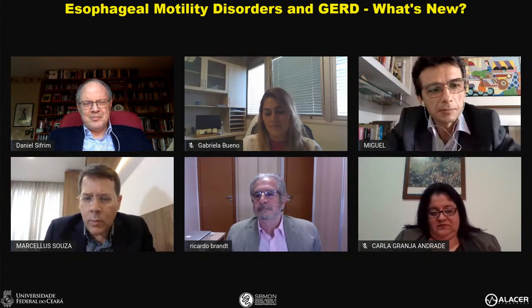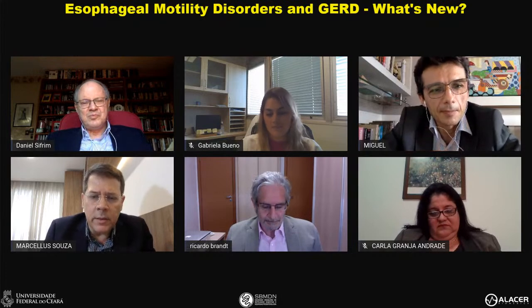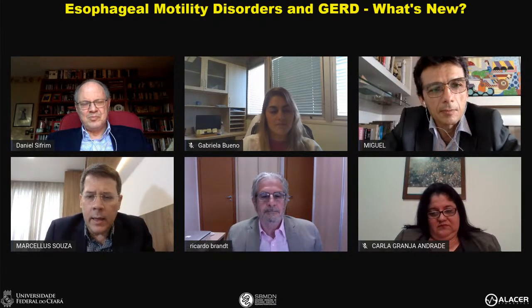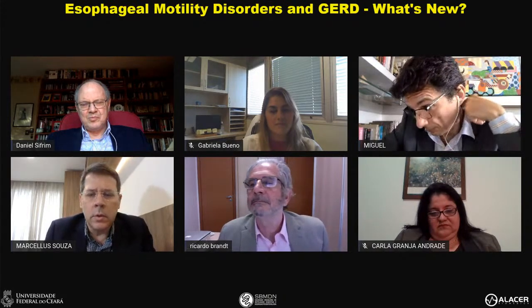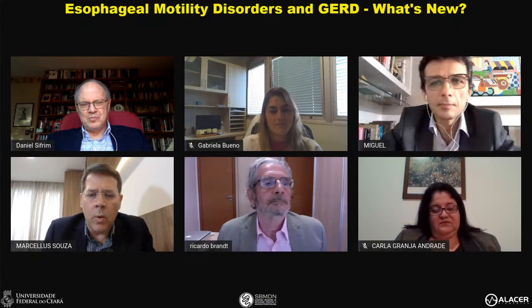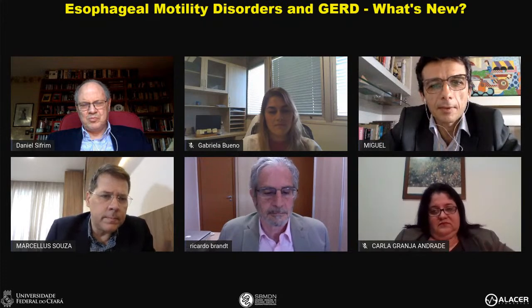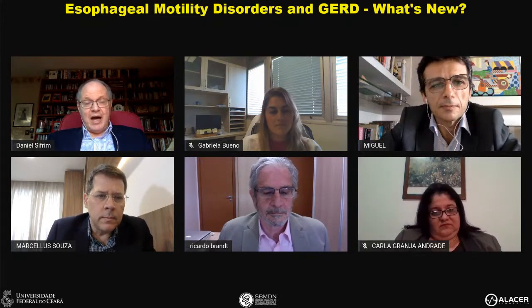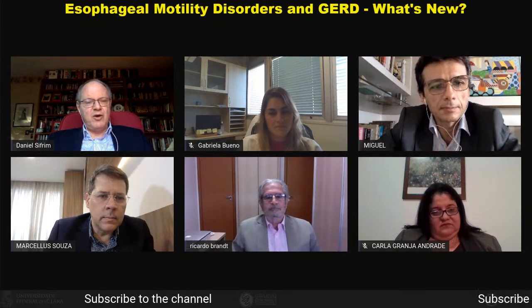One question is, what is your opinion about the duration of the pH monitoring? Is 24 hours the best time, or do we need more time to know what is happening in the esophageal disorders? I must say that the ideal scenario would be more time. More time you can have with wireless pH metry.